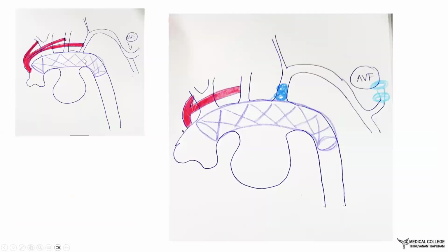So this was the initial plan that we had on the day of our procedure. But this is what we finally ended up with. So after surgery, this bypass was there. There was a bypass to the left common carotid. So post this, our plan was to put in a TEVAR stent graft as was planned.